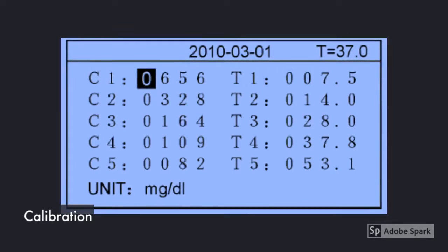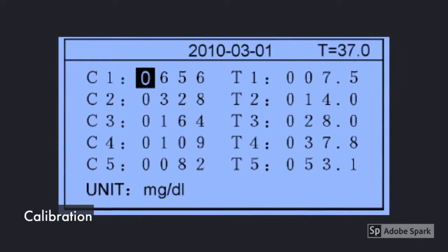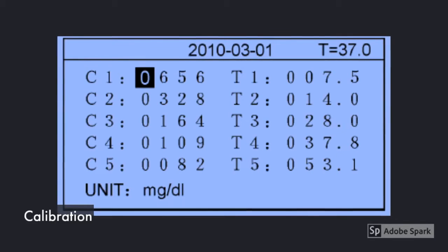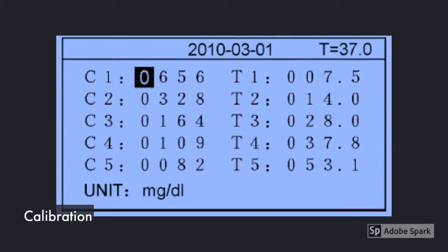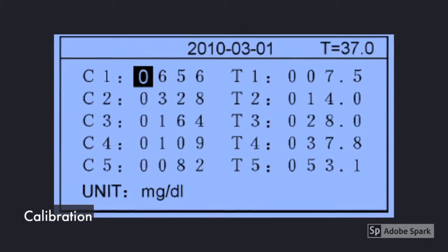The calibration interface screen is used to enter the concentration values and clot times to determine the calibration curve for fibrinogen. The values for C1 through C5 are calculated by the user based on the dilutions instructed on the insert sheet for the TFib reagent. Once these concentrations are entered, the user will then test each dilution to calculate the clot times. These clot times are then entered on the screen to determine the calibration curve.